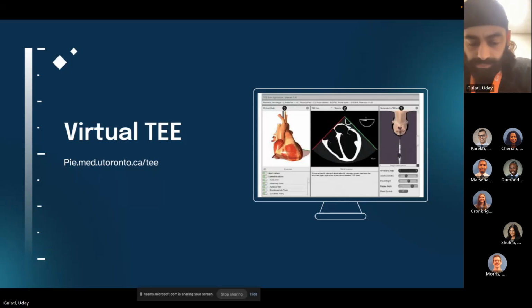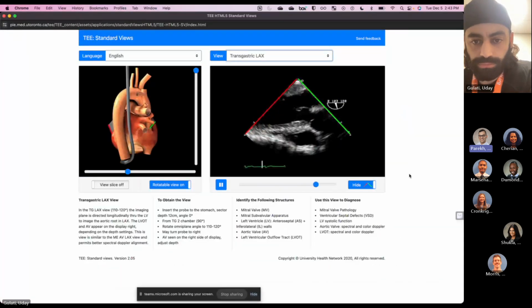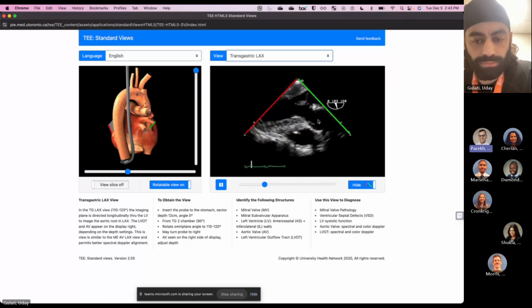And then when you're using that different view to get the cardiac output, I'm assuming because you're on the other side, you're going to be measuring above the line rather than below it for the VTI? No, you're still doing it like we always do, right? You're trying to measure right here at the outflow tract, not actually in the aorta. Right. Well, no, I'm saying the inflection, like the wave.